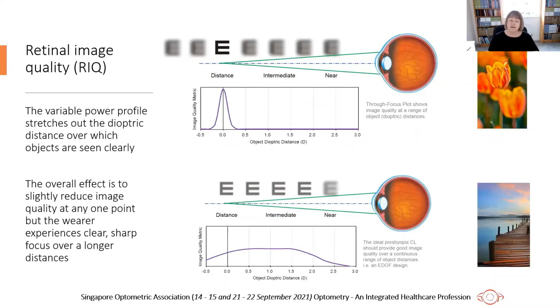So what happens at the retina level? Well, when you're looking into the distance at an object and everything else is blurred out, all of that energy from that object is falling on the retina and gives you the rich detail at that one point.